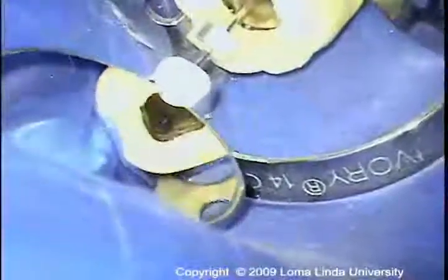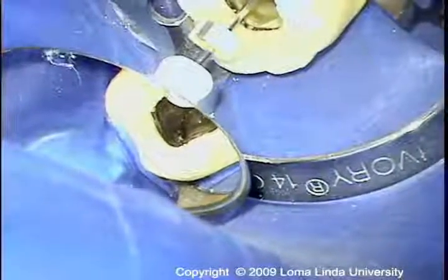As you can see, a minimal amount of tooth structure is being removed here. Then larger files can be used to bypass the instrument. We want to take these past the broken instrument and to the apical foramen.